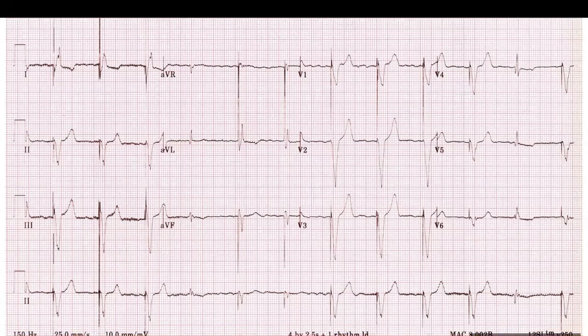Yes. Okay, so now it's pacing all the time for the first 3 beats, right? Yes. And then, oh, there is a sensed beat. It gives an order to the pacemaker to inhibit pacing. And that's why you don't see any pacer spike over here. And then it resets the counter, and then, okay, I'm pacing again.